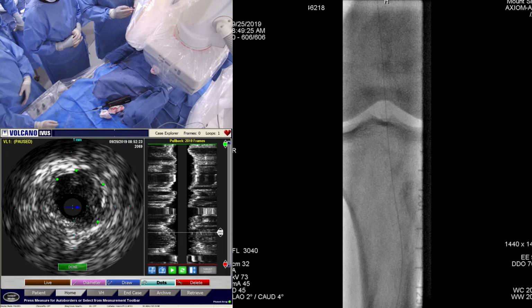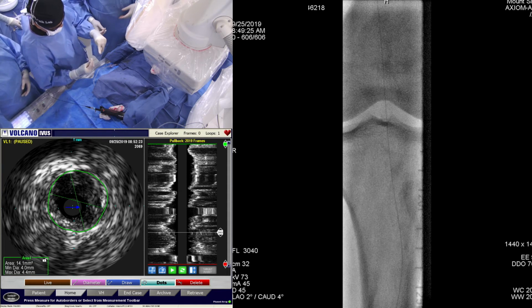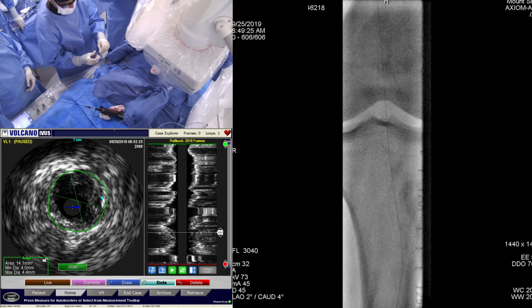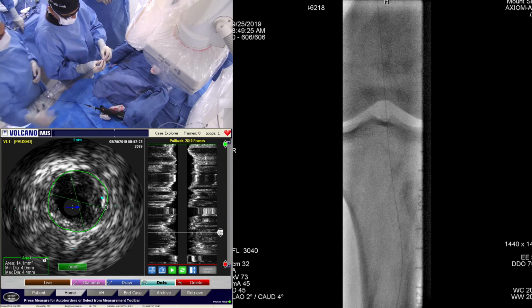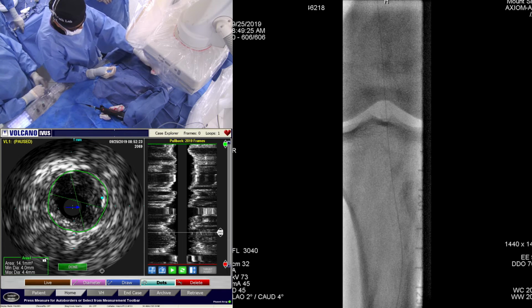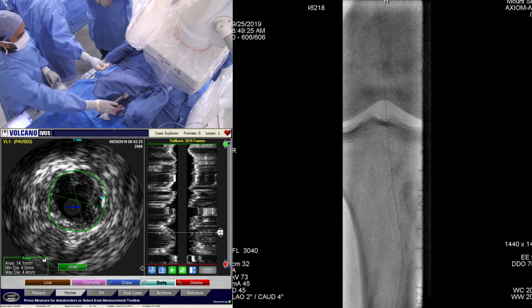As far as Supera stenting, I know that Haroon didn't quite hit on this, but the size of the Supera matters. If you do a 6.5 or a 6.0, at least in our experience, the diameter is around 4.4, so we can use a 4.0 or a 5.0 DCB without a problem. I'd probably use a 4.0 just to not dissect this and have to stent it.